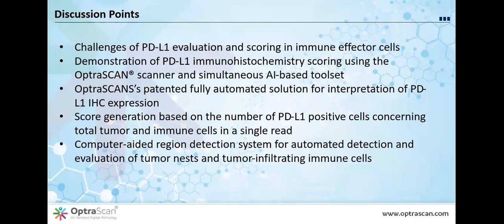So, here are some of the points of discussion for today's webinar. Challenges of PD-L1 evaluation and scoring in immune effector cells. Dr. Taylor would be shedding some light on the common challenges being faced by pathologists in PD-L1 scoring. The next points include demonstration of the PD-L1 IHC scoring using the scanner and the AI-based toolset.